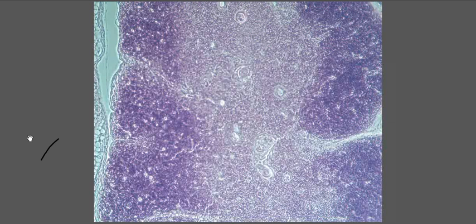Group 3, you want to tell me what gland this is? Group 3? All right, anybody want to help with group 3? No, it's not the pancreas. We already went over the pancreas, so there's no repeat. So which ones haven't we seen? No.